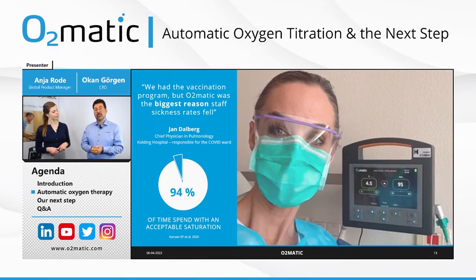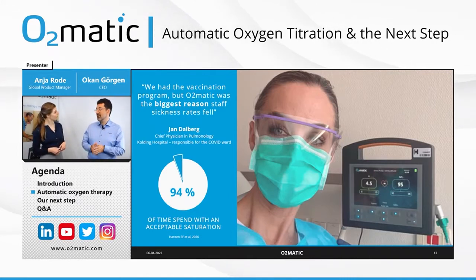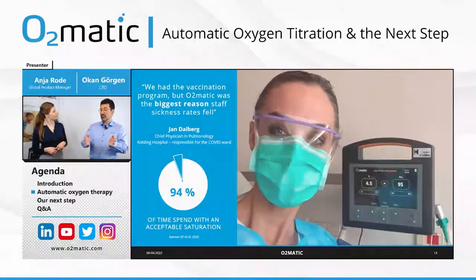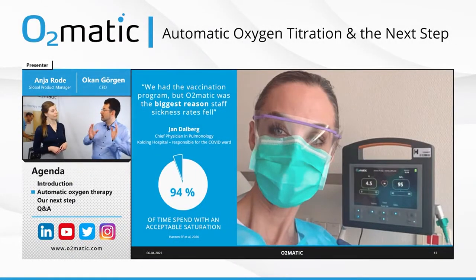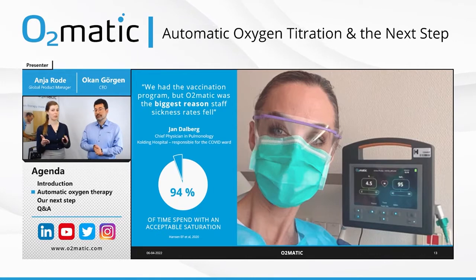And this is also one of the big milestones in oxygen therapy and automatic oxygen therapy: we could now see under COVID that the knowledge about how potent and dangerous oxygen is becoming more and more aware. So when WHO came out with guidelines saying keep COVID-19 patients between 92 and 96 if you don't know anything else, keep them there. If the patient has other symptoms, of course, there are other guidelines. And these 94% is plus minus 2%. That's still an acceptable range of the oxygen saturation following the WHO guidelines.